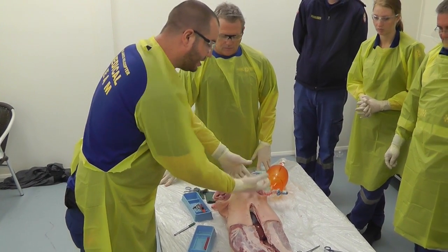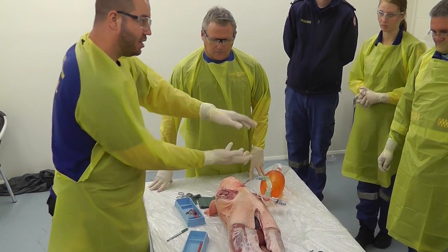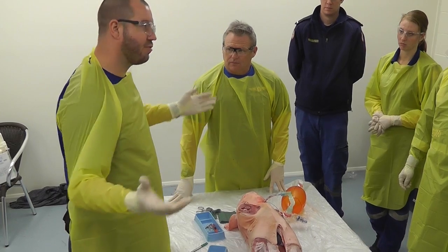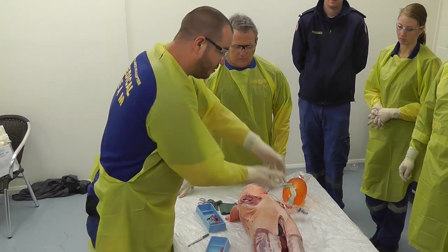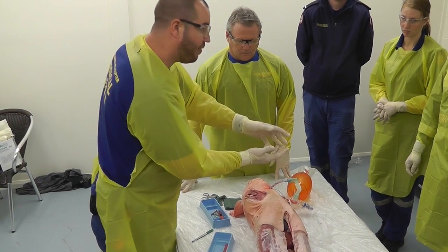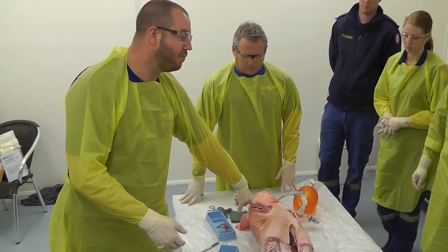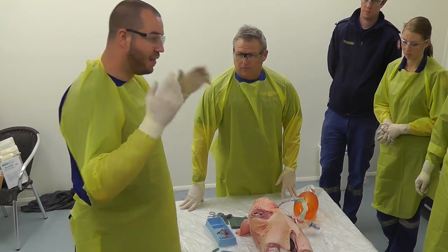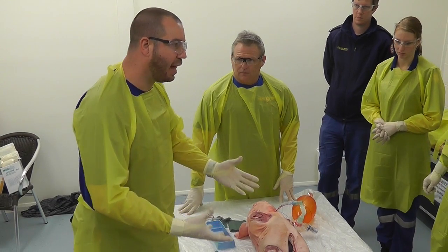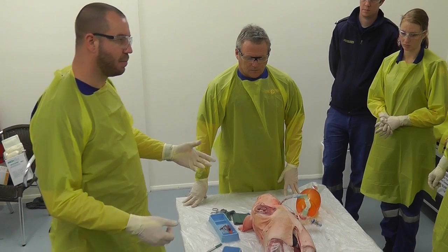You are going to deliver the heart and inspect it in all aspects — anterior, posterior — because if you plug an anterior hole and then fill them up, the blood is just going to go through that posterior hole and you have done no good. Deliver that heart, inspect all surfaces, identify any holes, close those holes, and then whilst you have got IV access before you have released that tamponade, start to fill them up so that the holes in the bucket are closed. Don't waste your blood too quickly if there are already holes in the circulation. Wait until those holes are plugged.